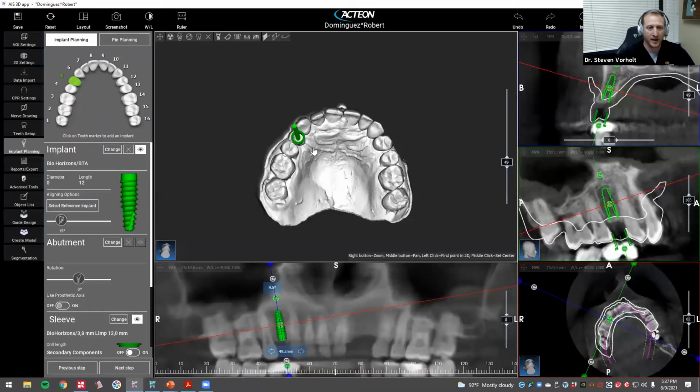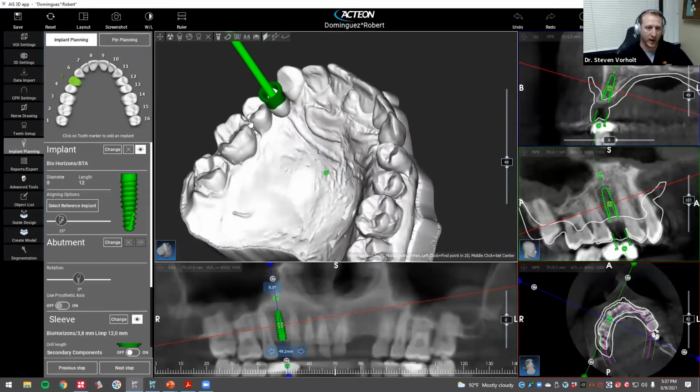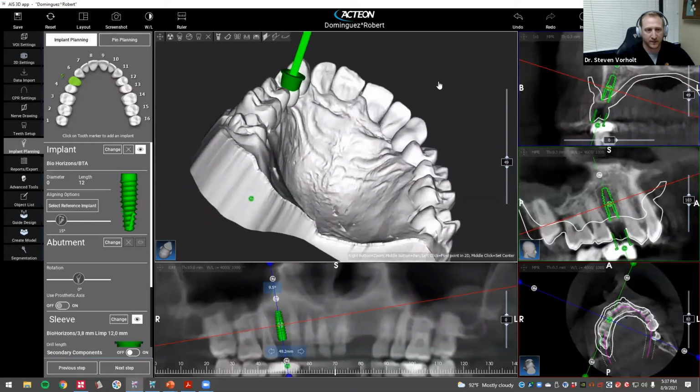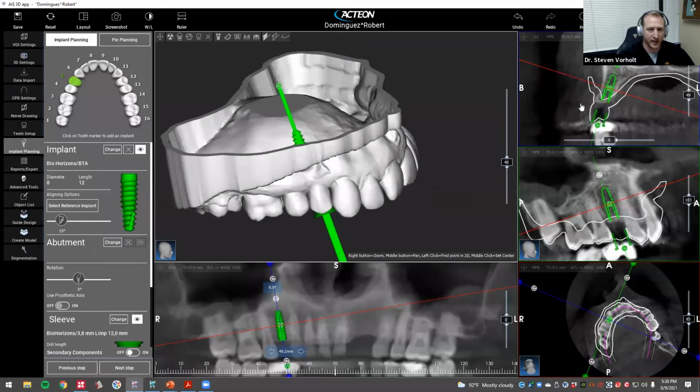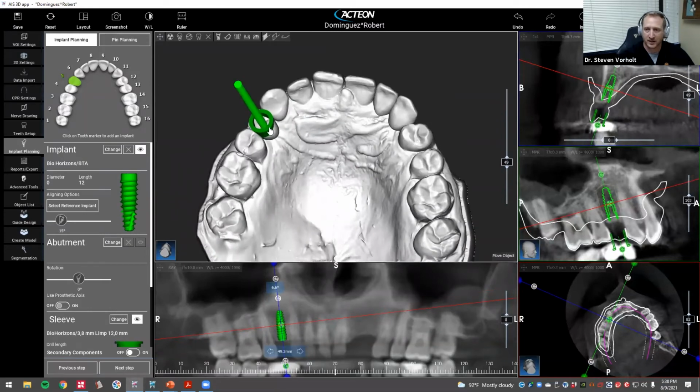I'm going to hit apply. And now I can really take a look at my positioning based on Mark's wax up. So I like that positioning. If I didn't, I could certainly come in here and we could tweak a couple things, but we like that positioning. That looks pretty good. Okay, so we're coming out roughly near the central groove, coming through the contacts. Maybe that's a little bit over, maybe twist it this way. And when you're doing freehand, you don't need to be super exact, but certainly when we're going to be making a guide, a physical guide, we want to make sure that this is exactly where we want it to be.